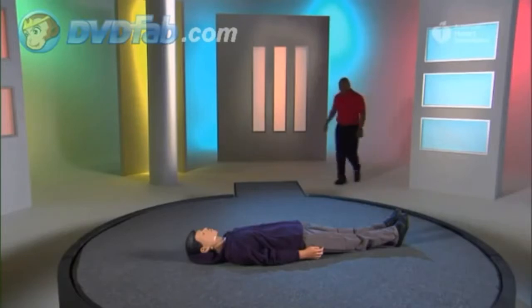We're going to show you a demonstration of all the steps together from beginning to end, including the use of an AED. Pay close attention because you'll get a chance to practice afterwards. If you find a person who may be ill or injured, first check to be sure the scene is safe.